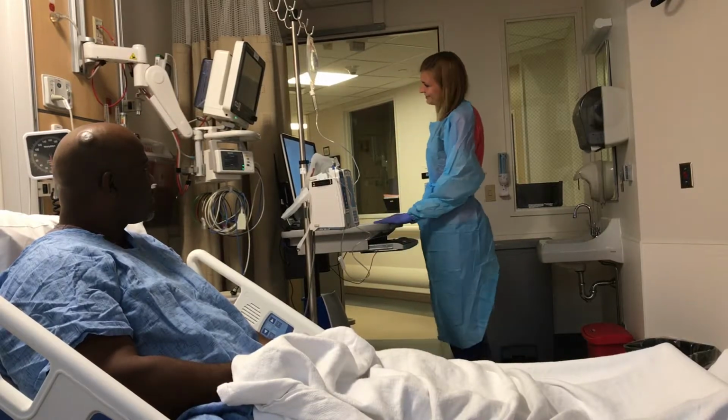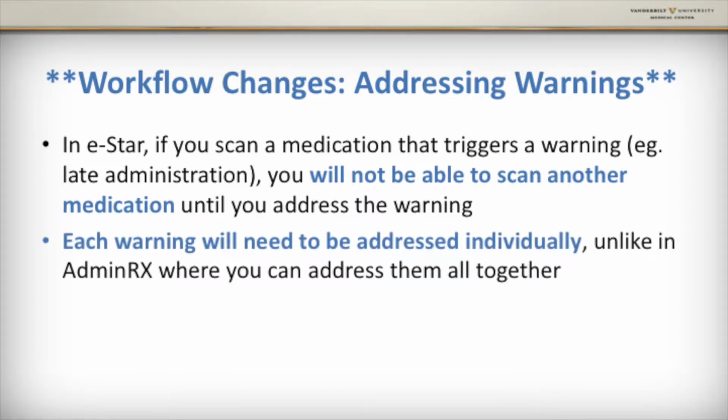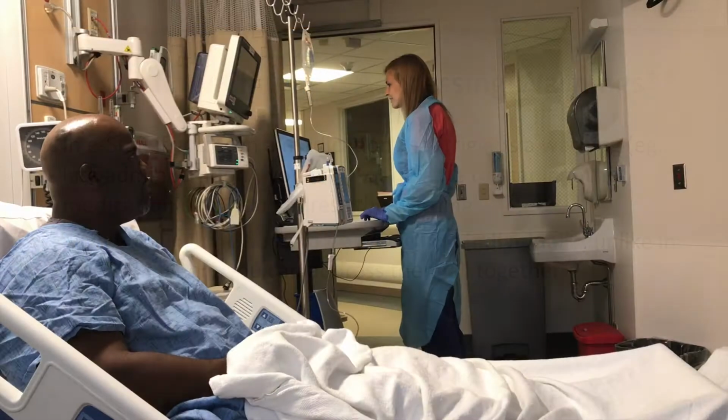Oh, there's a warning. In eStar, if you scan a medication that triggers a warning, like if you're giving it late, you will not be able to scan another medication until you address the warning. Each warning will need to be addressed individually, unlike in AdminRx, where you can address them all together.